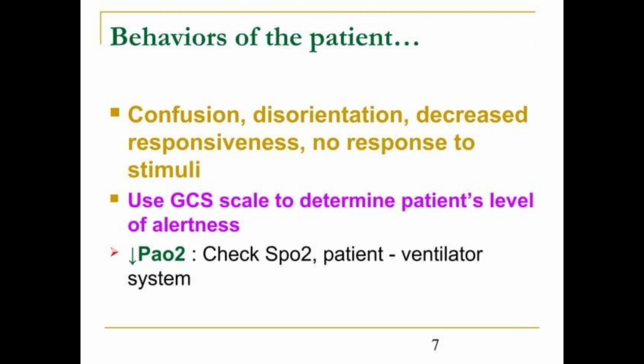Just like with agitation, sudden confusion is often an immediate red flag for severe cerebral hypoxia, and therefore we must immediately check for a drop in PaO2 by analyzing the digital SpO2 output and verifying the integrity of the patient ventilator interfacing system. By tightly marrying this sensor data with these behavioral parameters, we are able to build an airtight, life-saving ICU tracking network.